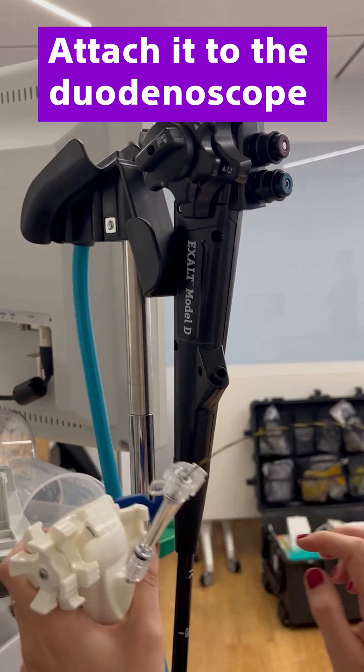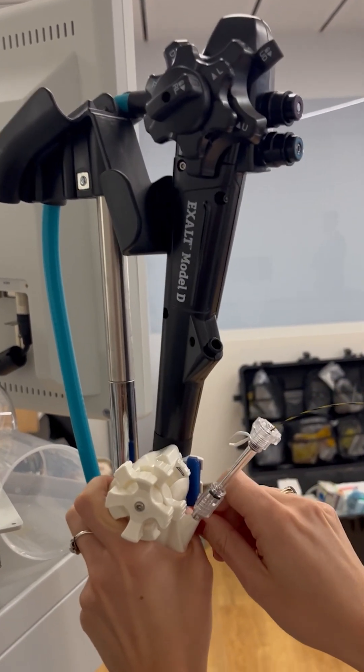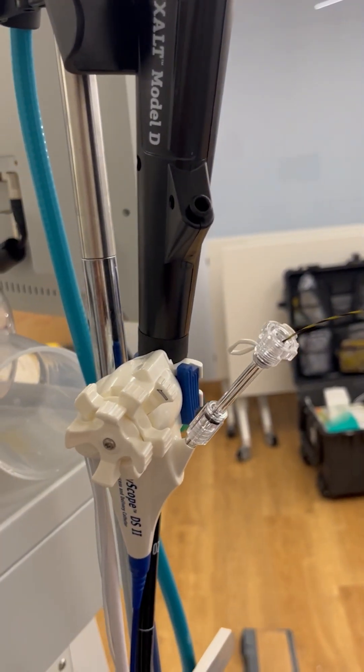Attach it to the duodenoscope, making sure that the articulation knobs are aligned, and pull the strap wrapping around and below the working channel.